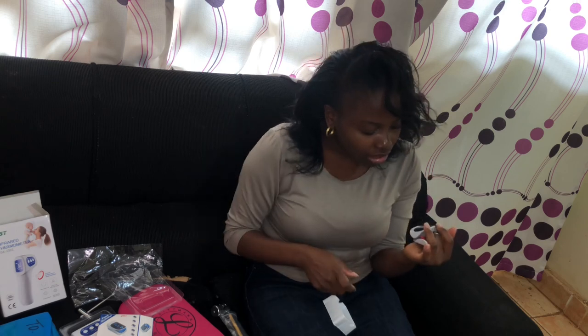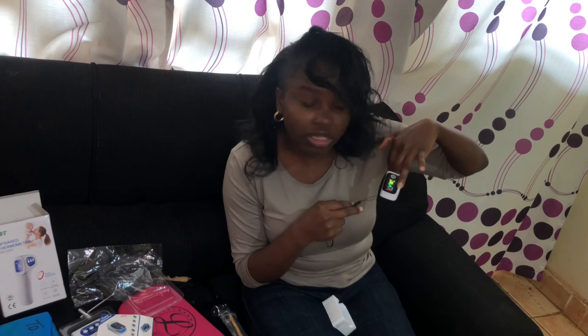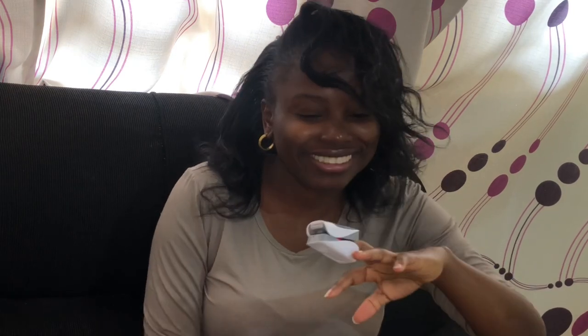It also shows you your pulse rate, and see, my pulse rate is at 76 beats per minute, and my SpO2 is at 98. You can see. So yeah, 76, and I'm pretty good, very good.